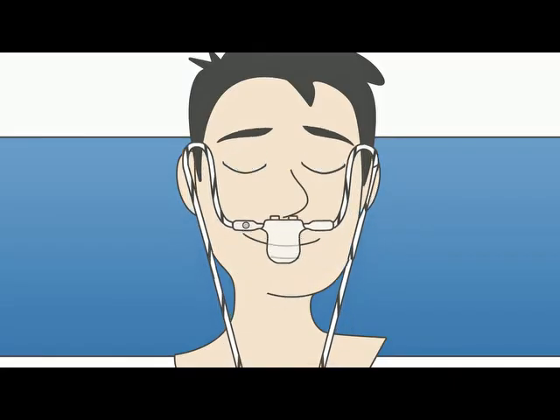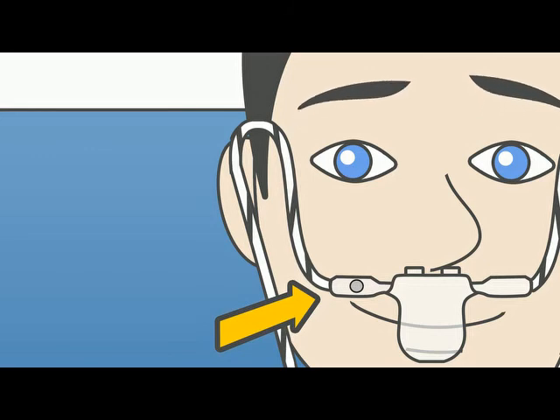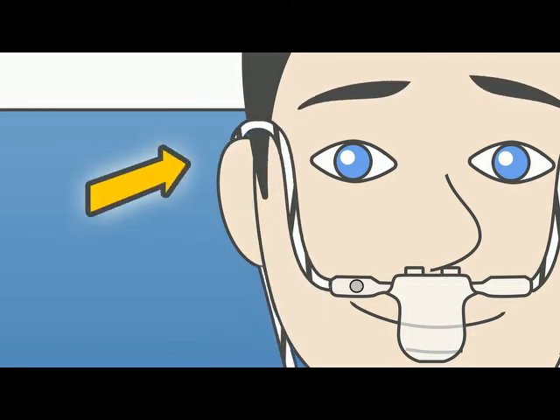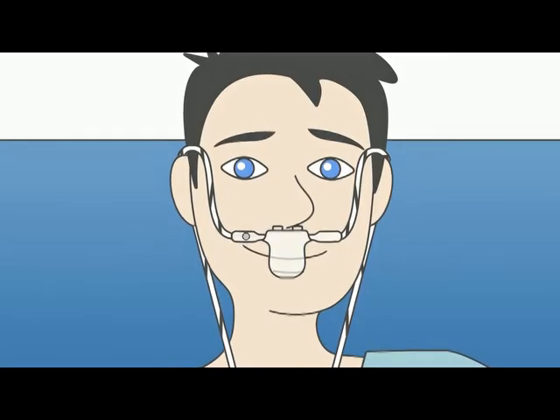Now, place the breath sensor with the two round humps under your nose. The sensor is positioned correctly when the single large hole is on the right side of your face and the tubing is placed behind each ear. You can tighten the slide ring upward and keep the cable in place by using the enclosed medical tape.